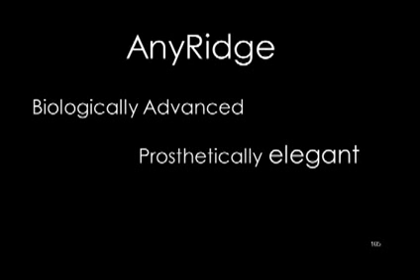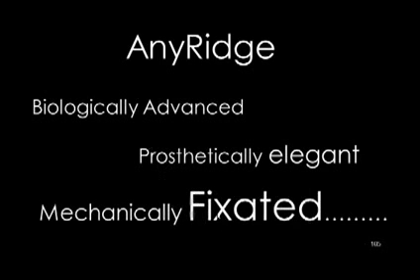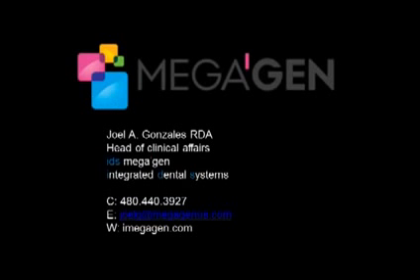It really is prosthetically elegant. And again, I'm speaking from a prosthodontist perspective because I used to work for a prosthodontist for many years, and it definitely helps you get better results prosthetically, and it's mechanically fixated because of the type of threads that it has.